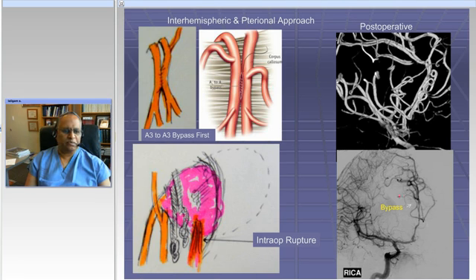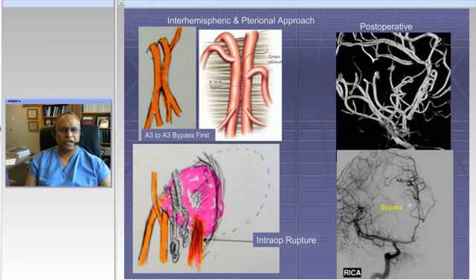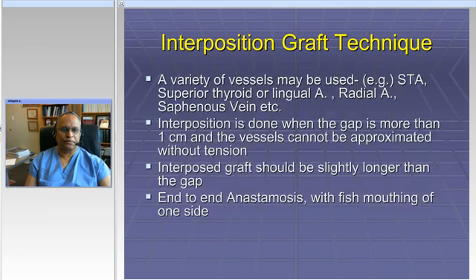No matter, because the bypass is filling nicely afterwards. This lady had, as expected, a complex postoperative course, but she made a very nice recovery afterwards and was able to return to her previous occupation as a college student.